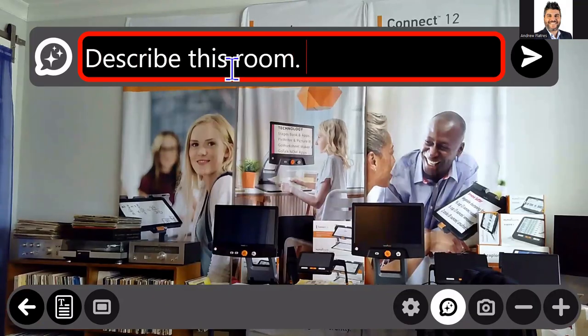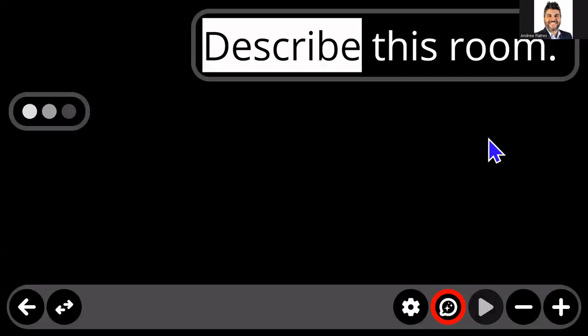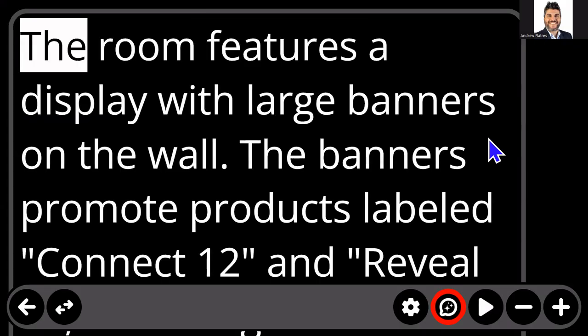Now we will be adding the voice input here. To be honest, we ran out of time to go back and address some of these interface options on the first question. So it's always there after the first question. But the same process takes place here. We send it to the cloud. We remember the answer from the magnifier, and we send an image of the room off to the cloud, and it renders a response to us.